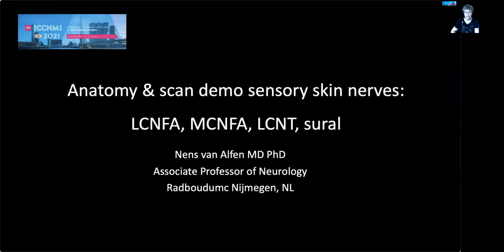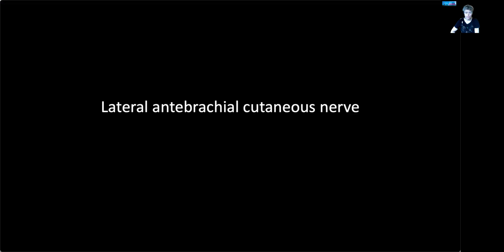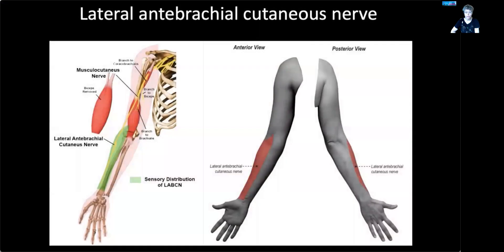Thank you very much. The next talk will be an anatomy and scan demo of the sensory skin nerves. We will start with the lateral antebrachial cutaneous nerve, or the cutaneous nerve of the forearm. Here you can see its nerve territory and the skin area innervated by it.